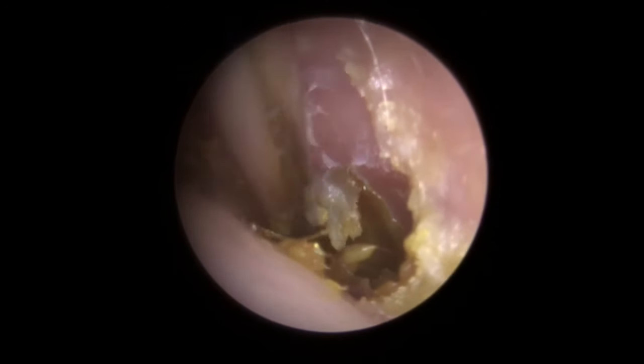You can see it's only covering that very top section. Now the majority of vibration to the eardrum happens at the bottom section where it's a much wider area — not so much at the top section. But I'm just going to tidy up as much of this as I can. We're getting some bigger chunks away there. And that little hair can come out as well. So just, you can see as we peel — we've got a grip. It's just starting to pull on the eardrum underneath. As we're pulling this, you'll see there's a little bit of flexion to the eardrum as we move it. So for safety, I would just prefer to leave this alone now.